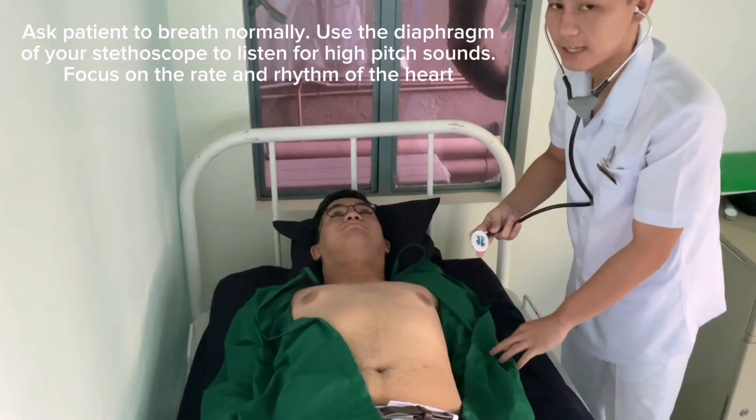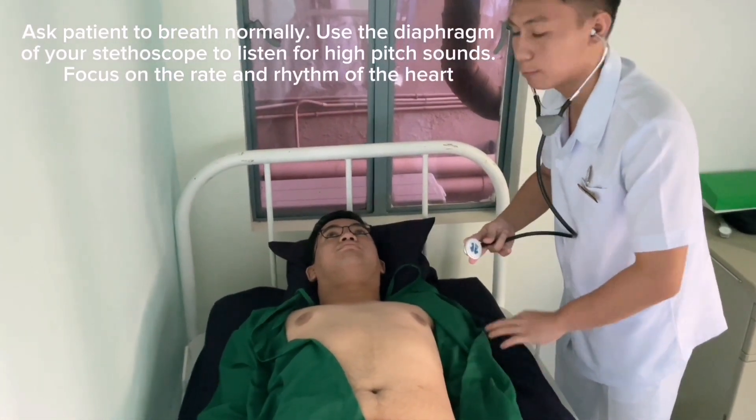Then auscultate once again, instructing the patient to breathe normally.